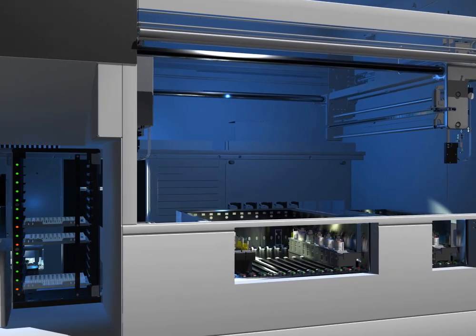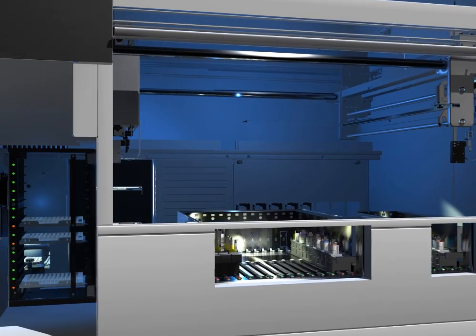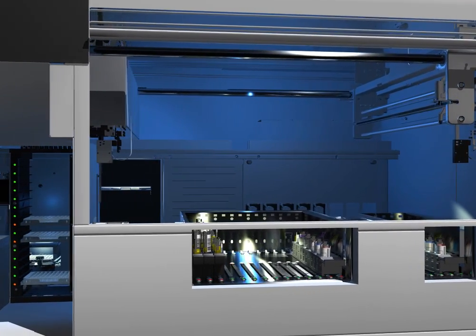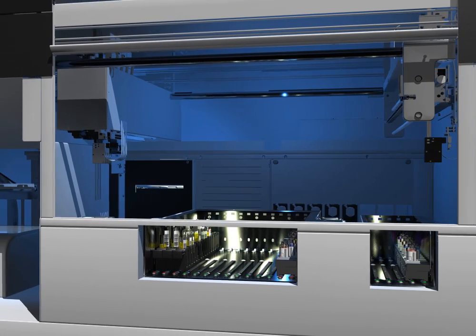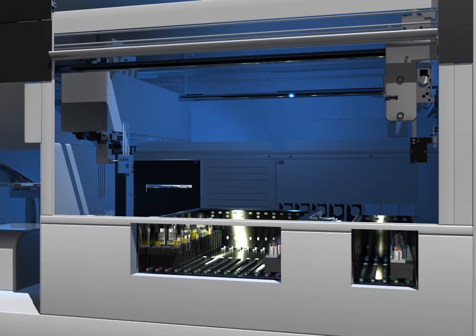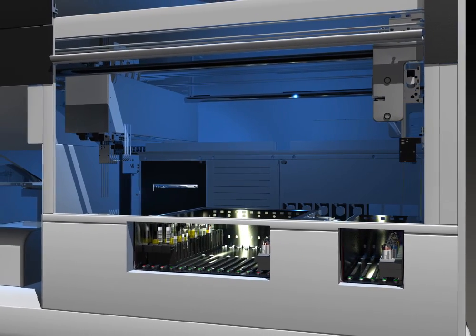NEO is comprised of seven hardware modules. Each module works independently and simultaneously to process your workflow in the most efficient manner.